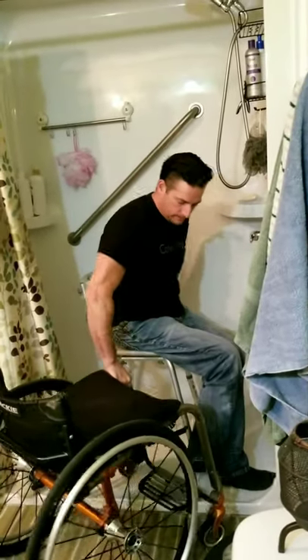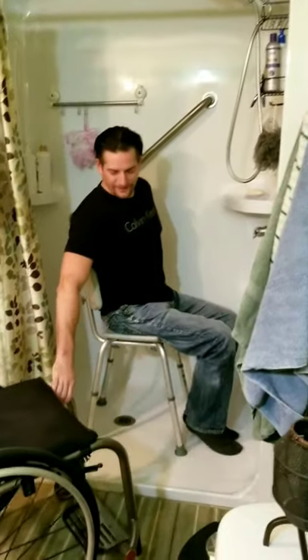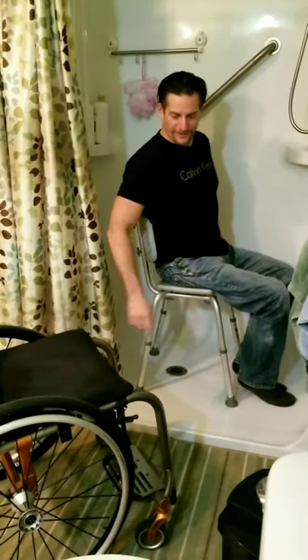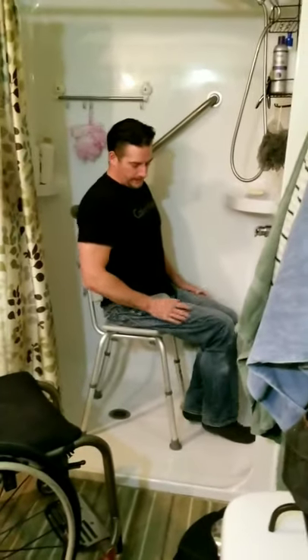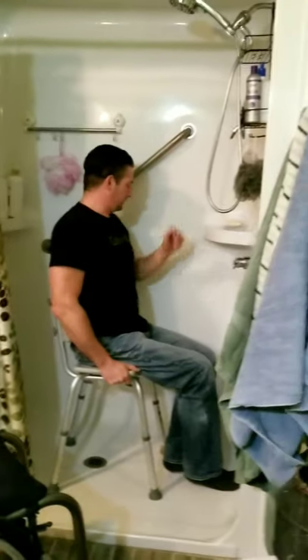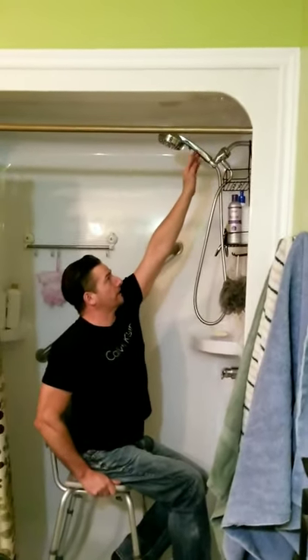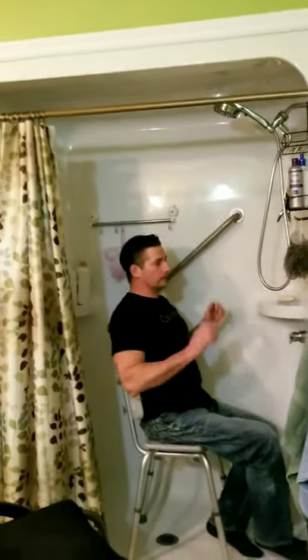Just like that. Then I put the shower chair in the shower and close the curtain and I'm ready to shower. I sit high enough in my bench where I can reach my shaving kit and the shower controls.